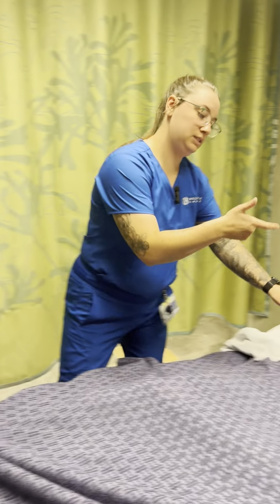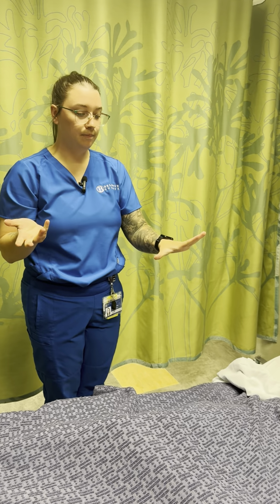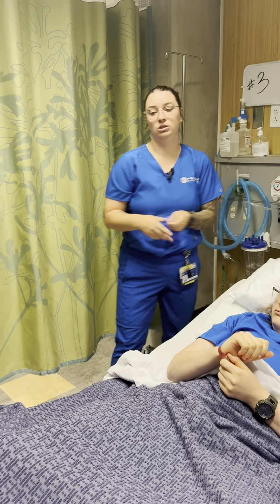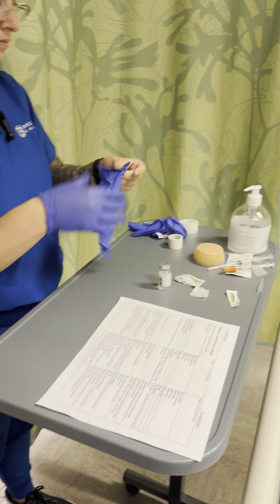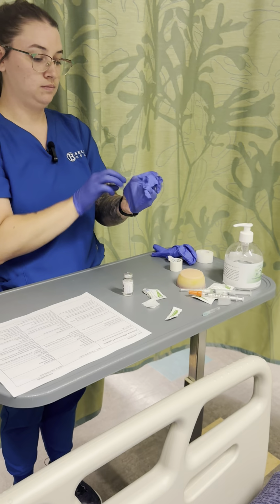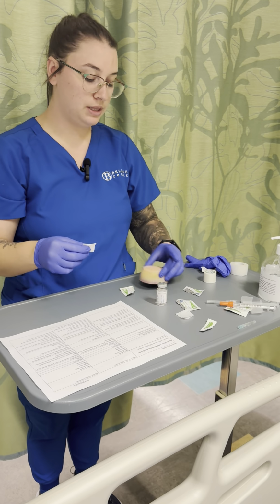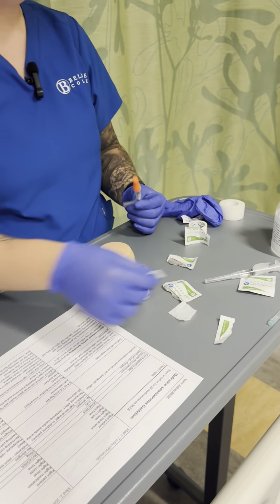Before I give this medication, I'm going to scan, and then I will scan both of my medications. All right. And then due to student safety, we'll be performing it over here on a little skin pad. So we're going to go right over here. All right. So we'll start with the subcutaneous. We would clean the area. We would make sure that that is dry.